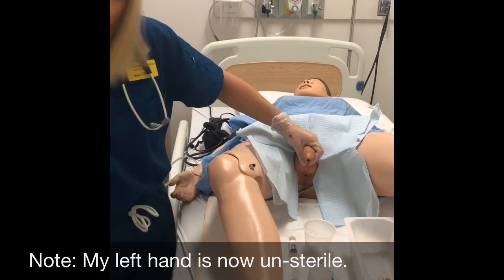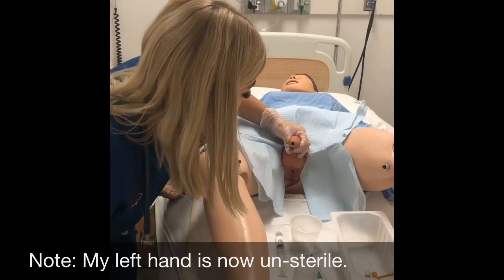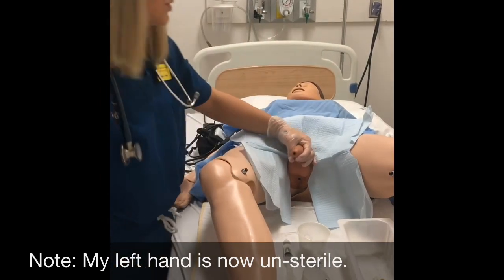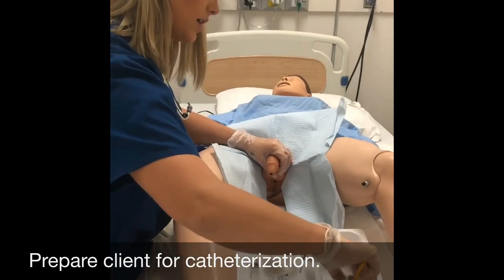Okay, so I'm going to pop my tweezers there, and I'm also going to examine the penis for the penile meatus, so I know where to insert the catheter. Okay, Mr. Mancini, I'm preparing to insert the catheter. So I'm going to take it out of the lubricant.